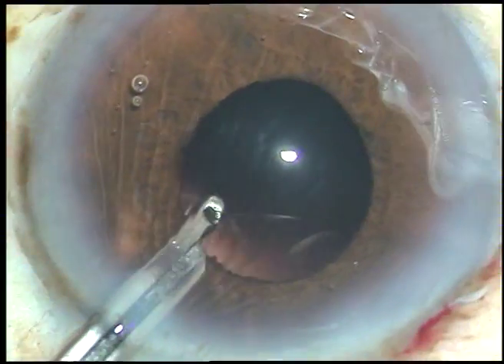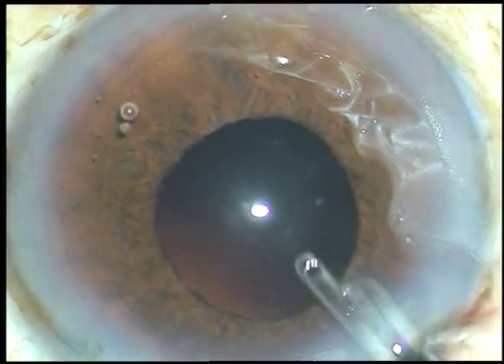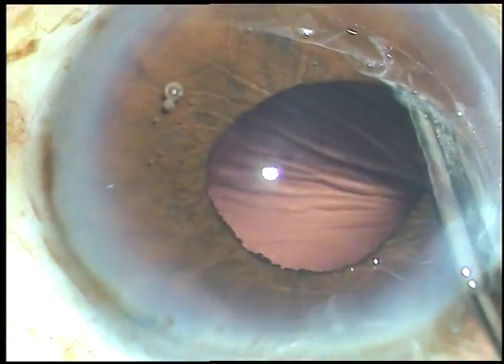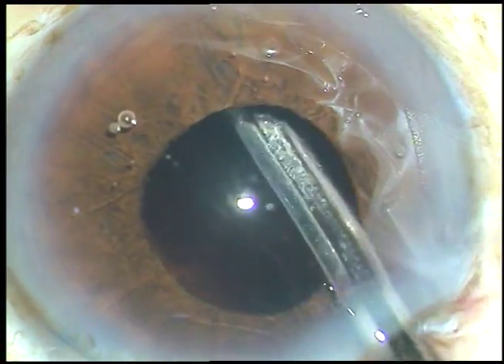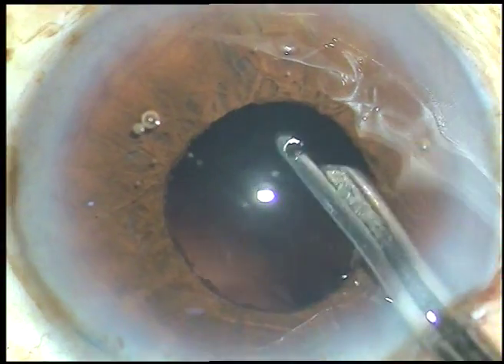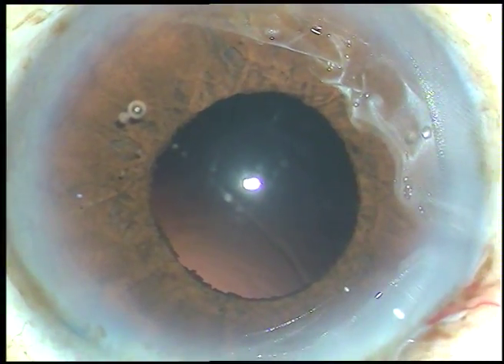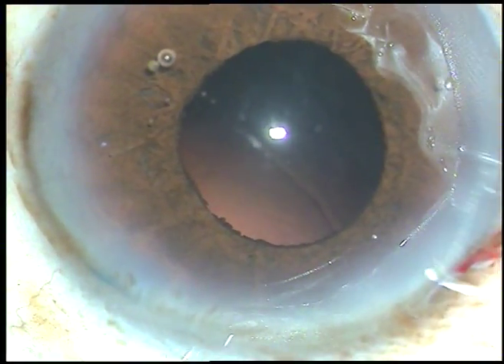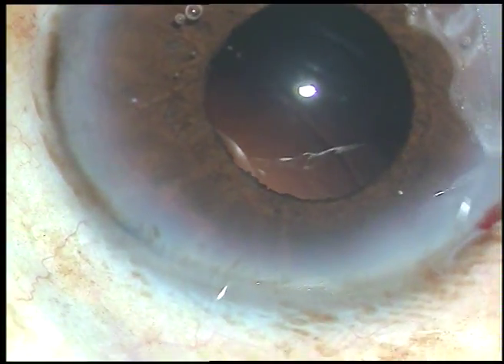The cortex has been removed. However, I must check with some instrument to see if there is any cortex remaining, or if there is some cortex hidden by the iris. There is an instrument whose shape is like the letter Y. After injecting viscoelastic substance, I am going to use that instrument to check if any cortical matter remains anywhere.